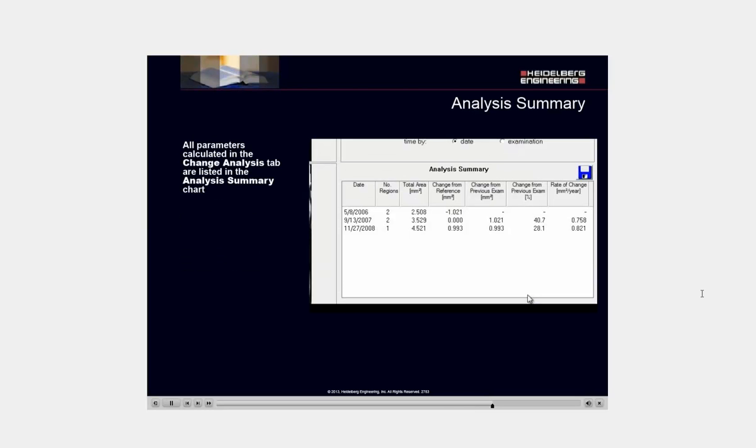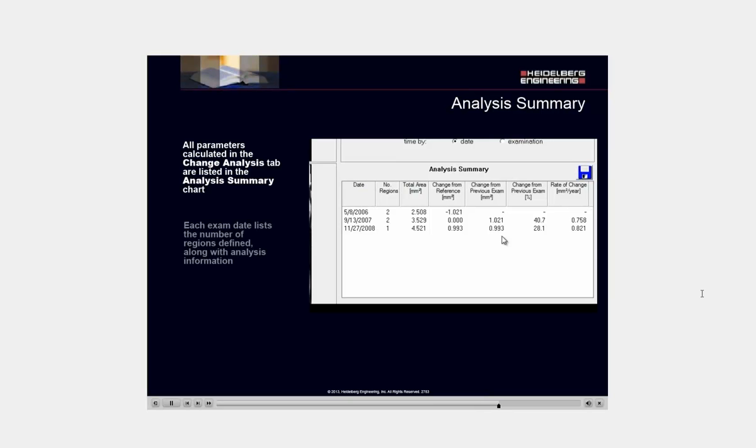All parameters calculated in the change analysis tab are listed in the analysis summary chart. Each exam date lists the number of regions defined along with analysis information.